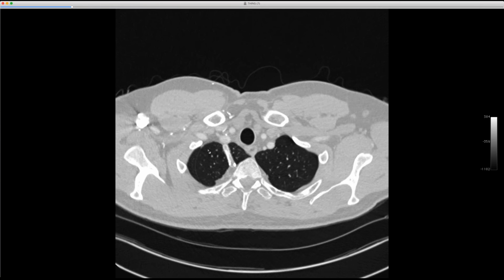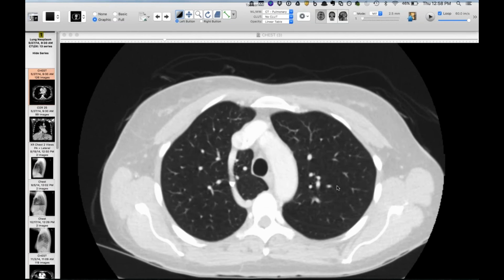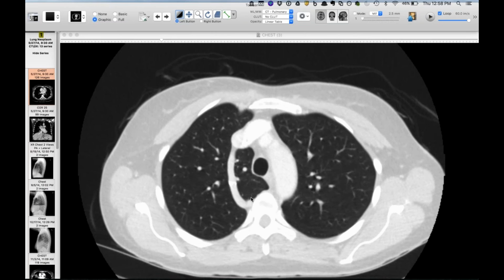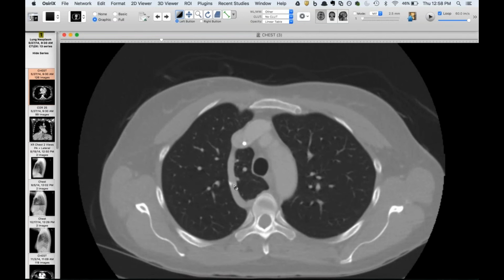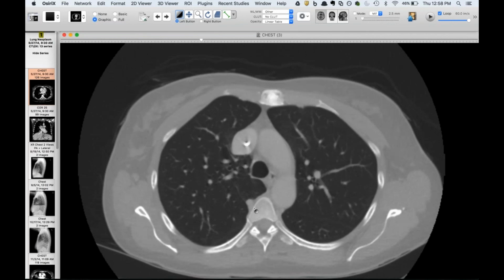Okay, Travis said he had one. Let's see what he has to share. Yeah, I can show one really quick. You see my screen? Yes. This is the before and after. You can see the nice azygous vein even with the valves in the middle of the fissure here.